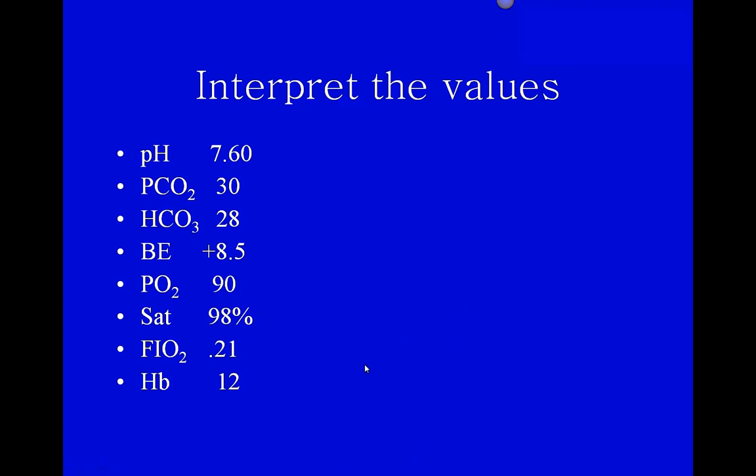You have a lot of opportunities to practice this in your packet or in your assignment folder this week. Here's one way you could approach the quiz. The quiz questions, I'm going to give you 3 blood gas results. So one way you could approach them is just this way. What if I say, find the one that shows metabolic alkalosis? You may be able to just look at the pH and rule out the ones that aren't an alkalosis.